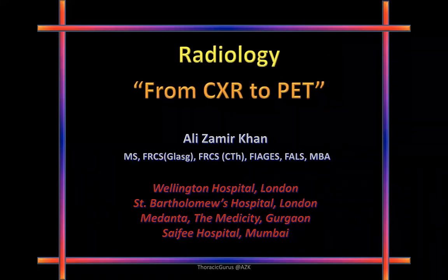Please make sure, everybody, that you have a 200-page notebook in front of you, a pen and paper in your hand, because we are going to try and identify structures. The whole idea of this topic is to understand normal anatomy. So everything that I teach is going to be normal anatomy. And if we are doing okay and we've still got time, then I've got at least 100, 200 slides on abnormal anatomy. But the main purpose of this talk is that you understand normal anatomy. That's the most important thing. The moment you know normal anatomy, then you can easily correlate into abnormal anatomy.